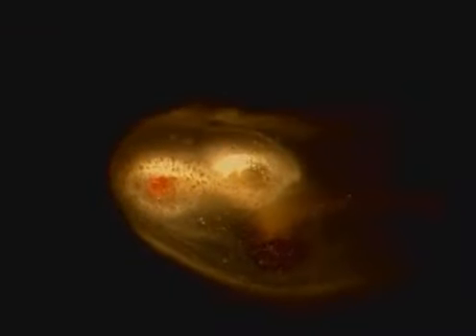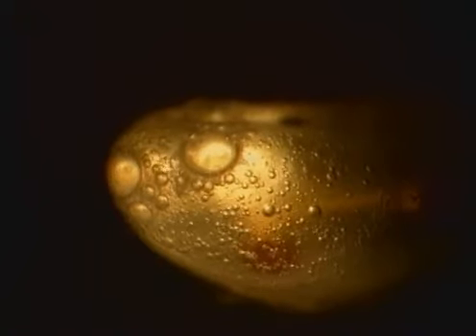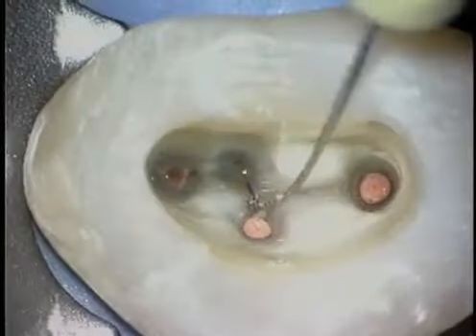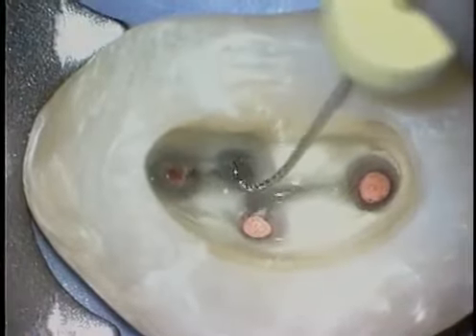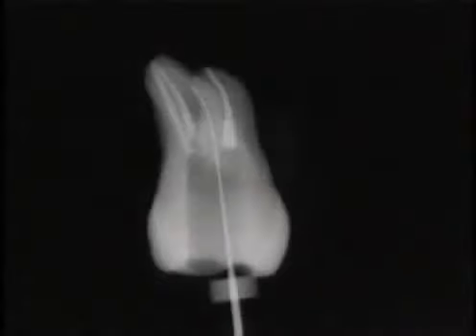Oftentimes, if you look very carefully into a tooth that's brimful with irrigant, bubbles can be seen emanating towards the occlusal table. When bubbles are noted, it usually means in this instance that sodium hypochlorite is reacting with tissue and liberating oxygen. The champagne test then can be used as a canal indicator. Solvent-filled canals are an opening for negotiating root canal systems.